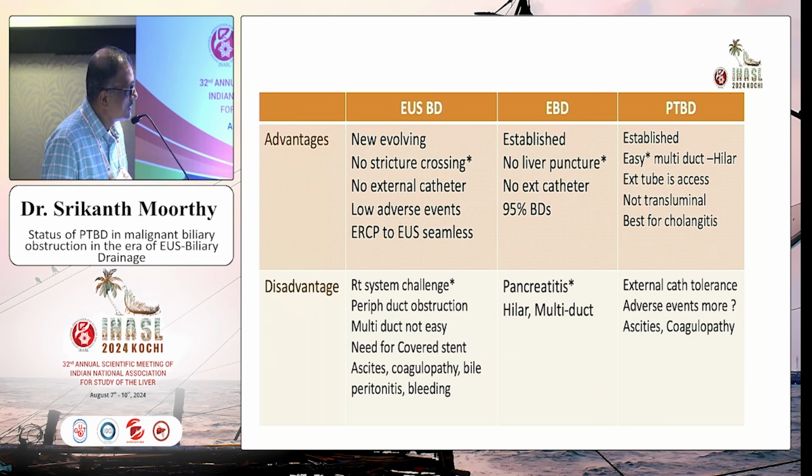Here, crossing the structure is important. There is no liver puncture in ERCP. That's a great advantage. And in PTBD, the multi-duct access from outside is also an advantage. In the other two techniques, there's no external catheter at the end of the procedure. We have an external catheter here. Okay.